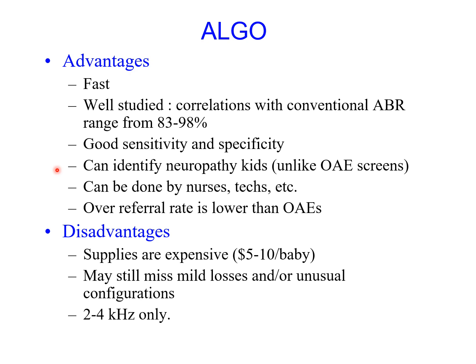On the other hand, if you use OAE as hearing screening, OAEs cannot identify patients with auditory neuropathy. So in other words, if you have a patient with auditory neuropathy, those patients will fail ALGO, so that we know something is wrong with them, including patients with auditory neuropathy.